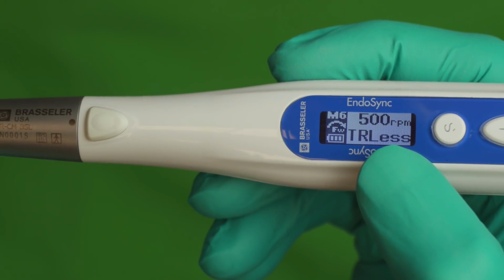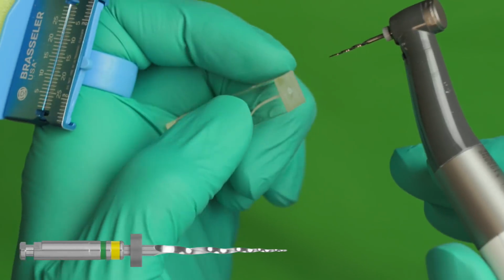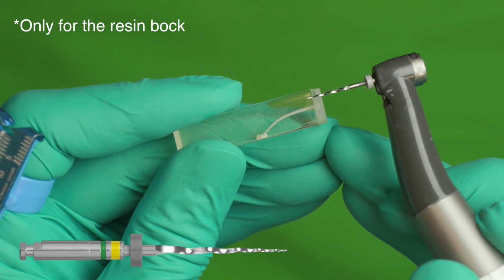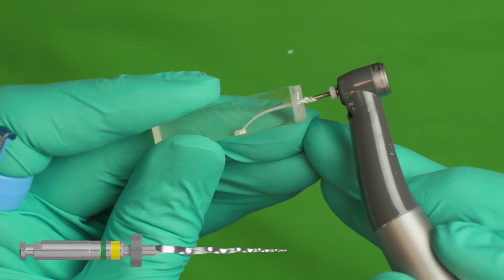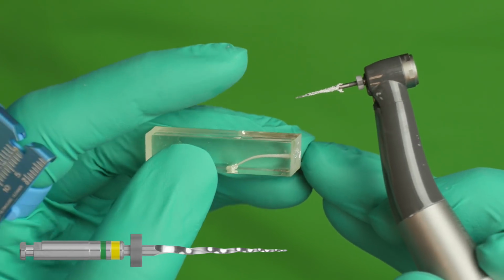So there's no OTR. We're going to use the 500 RPM but without any torque control so that we can get proper cutting in the block. Okay, so with that off, we're going to basically start by instrumenting using again just the rhythm motion. And the way that works is by having 1, 2, 3 light and kind of definitive motions.